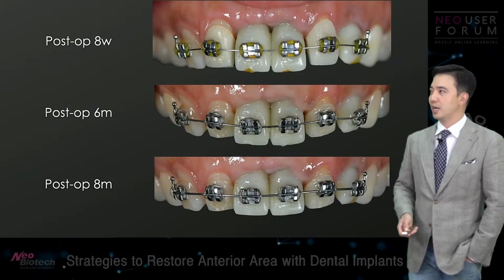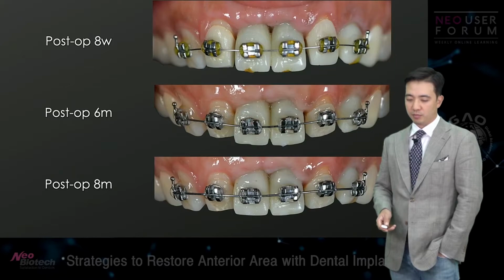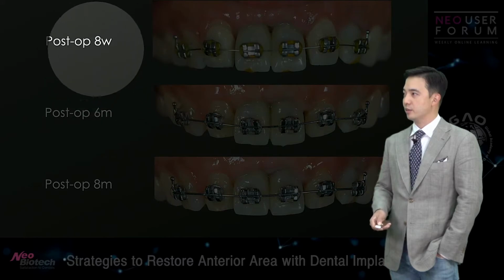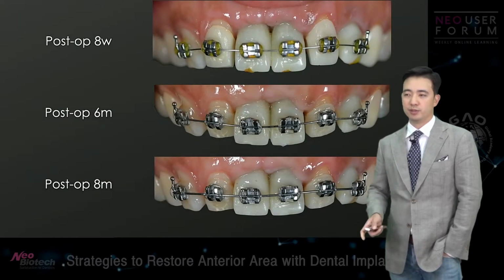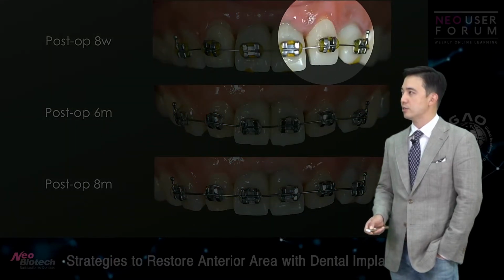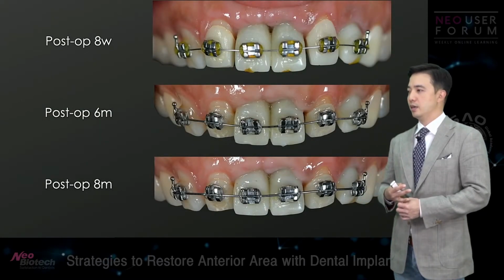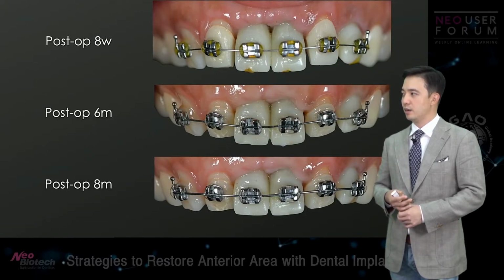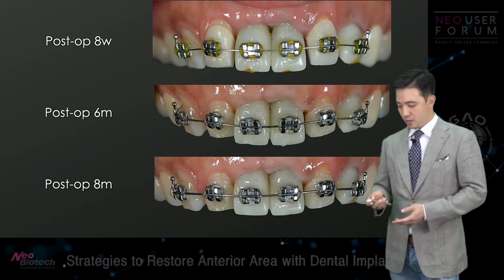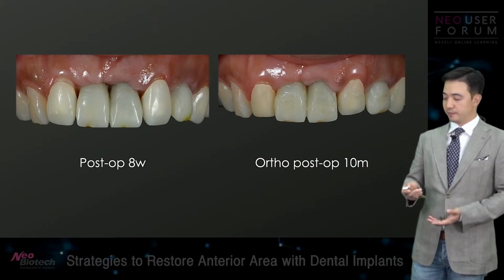So, well, what I do, and I really regret not telling the patient before everything happened, was that I should have done the orthodontics even before we went in for the surgery, right? Because we all knew that in the first place, the patient had recession on lateral incisors, and after raising that big of a flap, this was kind of meant to come as a result. So that was really my bad judgment. I'm kind of confessing, but yeah.